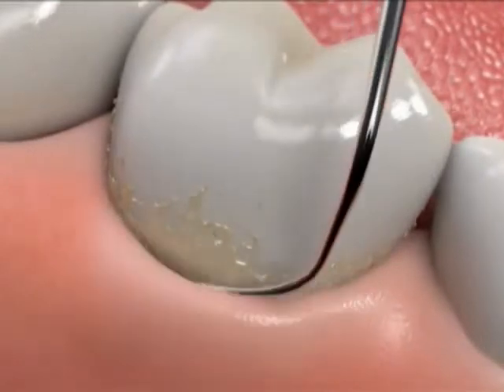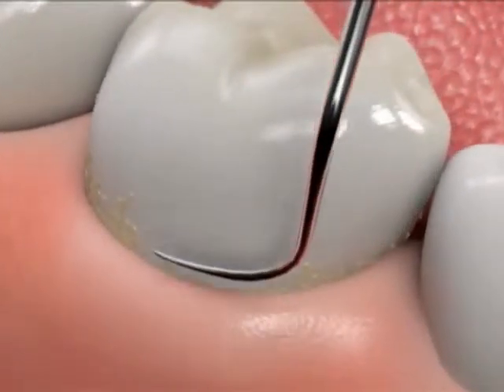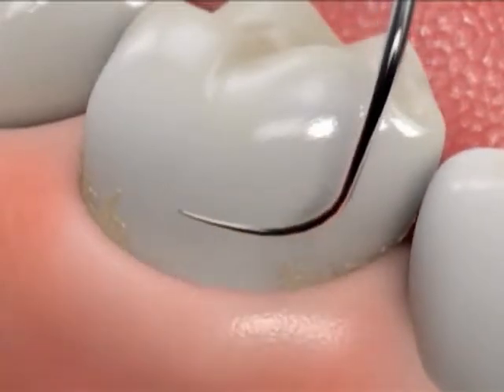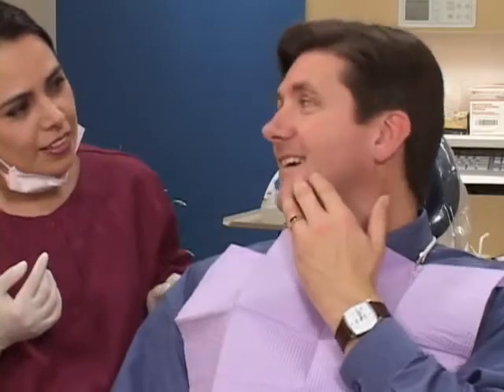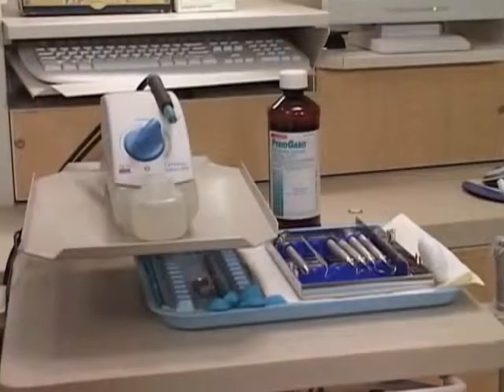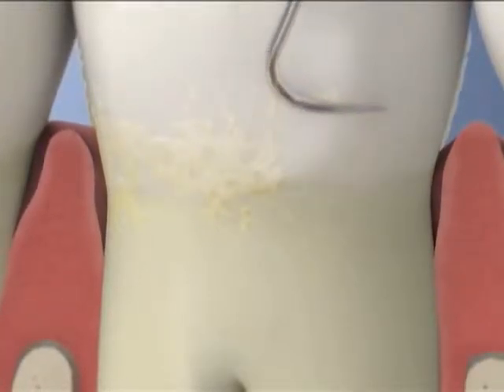A scaling and root planing procedure removes plaque, tartar, and bacterial toxins from the surfaces below the gum line. To keep you comfortable, we usually numb the area before the procedure begins. Then, using instruments like these, we carefully and meticulously remove the plaque and tartar and then smooth the root surfaces.